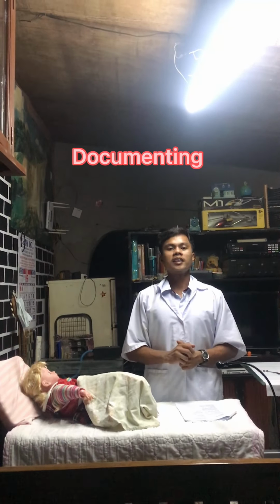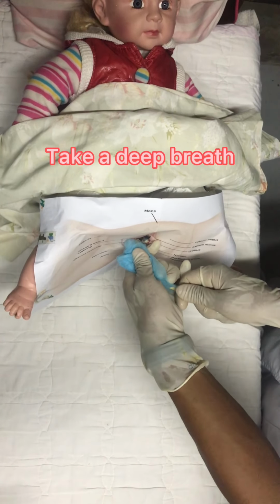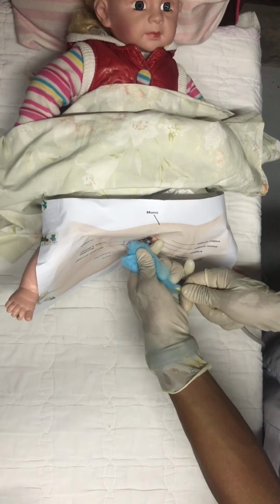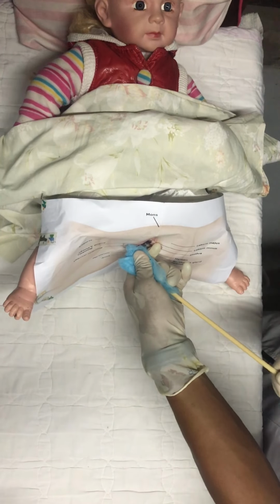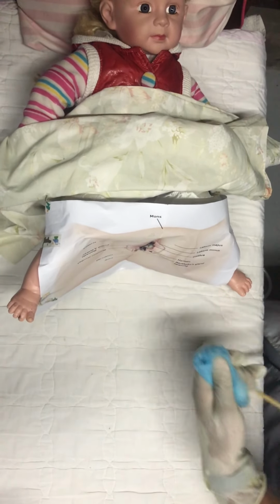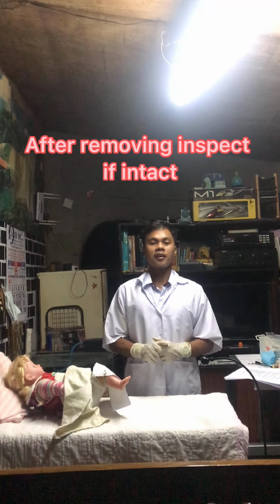Then place an absorbent towel and a mattress under the catheter. Then tell the client to take a deep breath. Ma'am, I will pull it now. 1, 2, 3. Then pull the catheter. After removing the catheter, inspect if it is intact, and if it is not, notify the physician immediately.